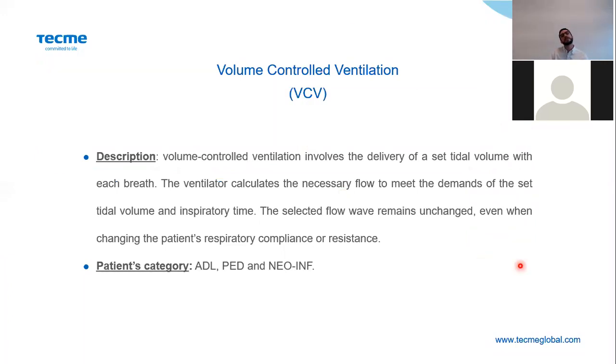So now we are starting to talk specifically about our ventilatory modes. The first one is volume control mode, or VCV. The idea here is that the ventilator delivers a certain amount of tidal volume each breath.